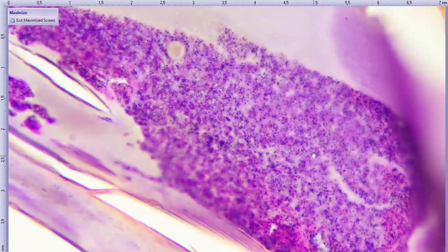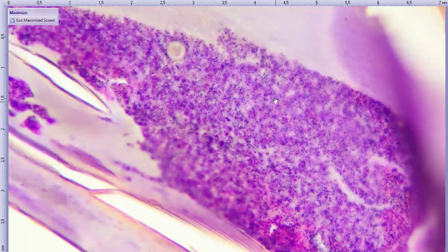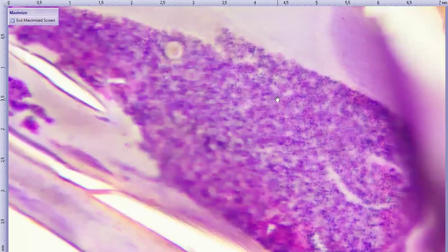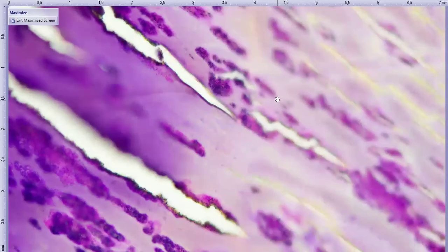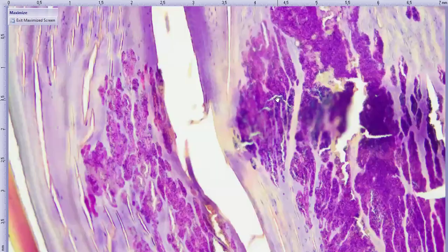And you can see that this is unfortunately as high as we can go. You can see that some of the organisms here do stain positively with the gram stain. And I will tell you, it might be hard to appreciate here, but these are much smaller than we would expect for E. cuniculi or encephalitozoon. So we did conclude that these were bacteria and gram-positive cocci. You can see their morphology a bit better through the microscope. And there was a little bit of variation in how well they stained with the gram stain.